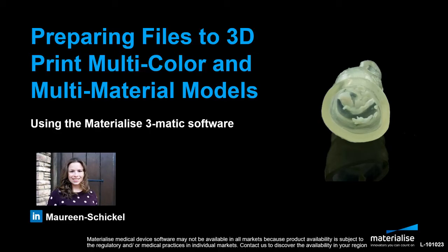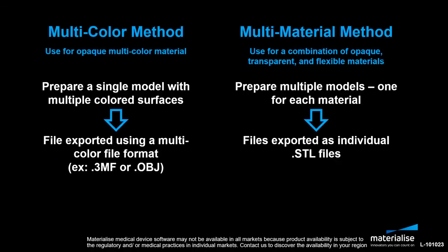These methods will allow you to prepare models to take advantage of the latest multi-color or multi-material 3D printing technologies. In this tutorial we will cover two methods of preparing files.